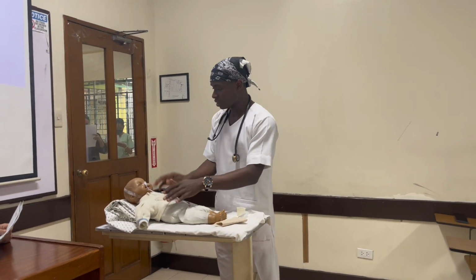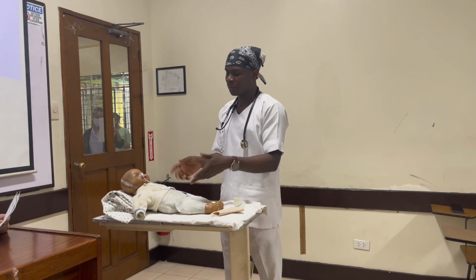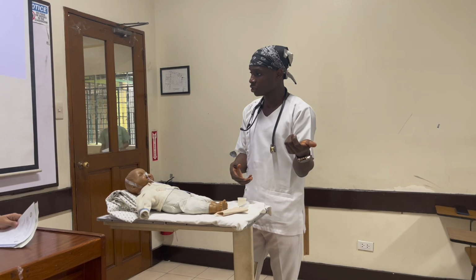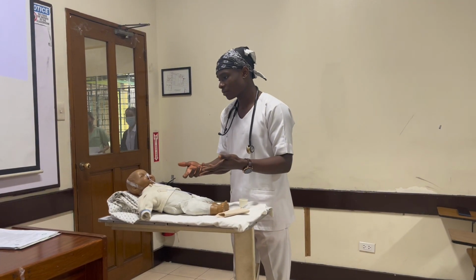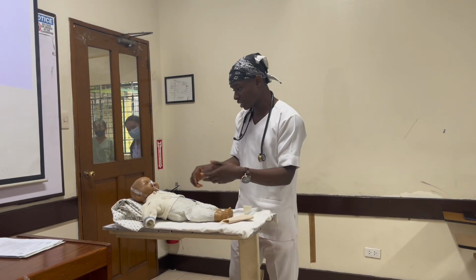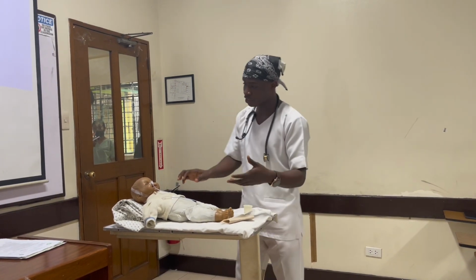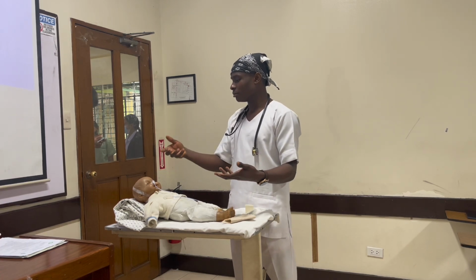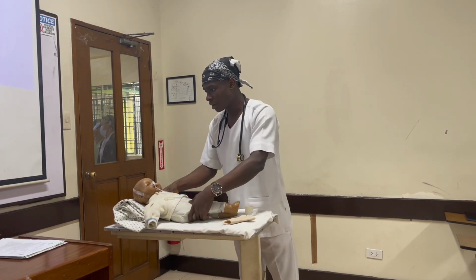The baby is already at 30 degrees. Before I place the baby, what should I do? I should ask the medical practitioner what position is necessary to place the baby. Then it's now time to clean up. I've already placed the baby. Maybe the medical practitioner said back side-lying, so I place the baby that way.